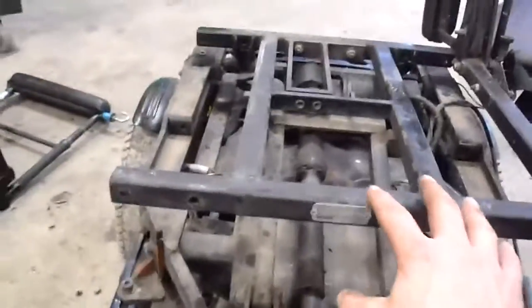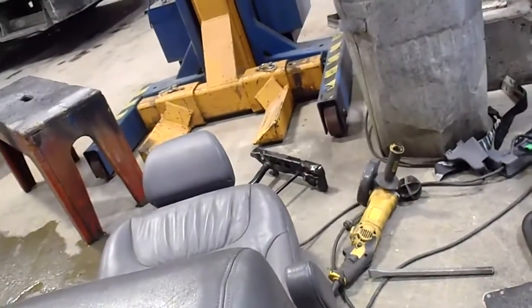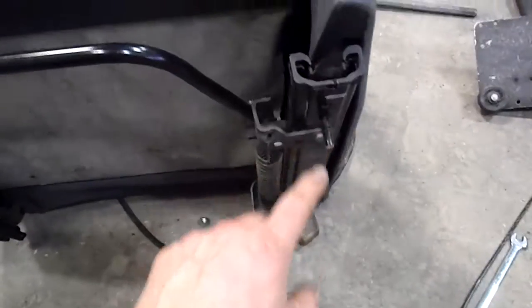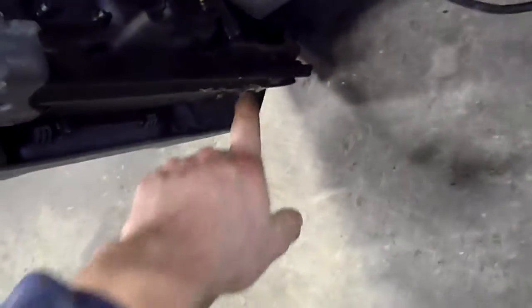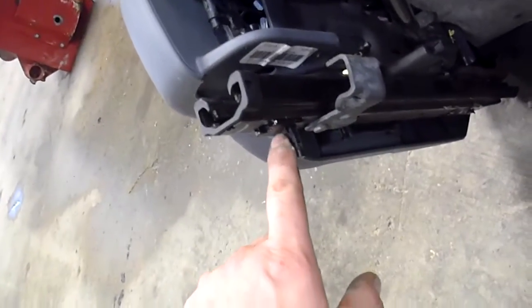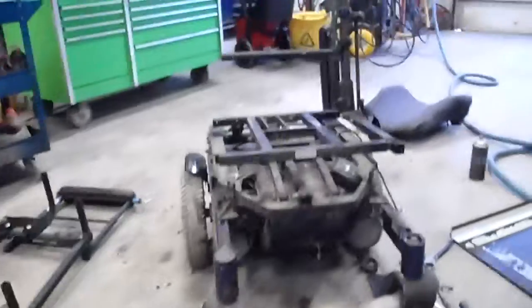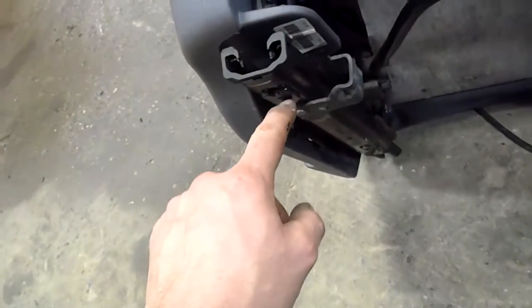Once that's all taken apart, I'm going to end up with this frame on its own. I had to take the quick release off the seat. It's laying up over there by the grinder, and I got 2 bolts here that go into the seat slide. So this is the slide frame on the seat. The back ones I had to cut off because it's like a rivet that goes through there. I might have to weld a bolt on. I got another bolt like this. But what I'm thinking about doing is making this similar to a quick release seat in the way that I might just put a hook on the back there, or something that pins in to the back of the frame on the wheelchair.